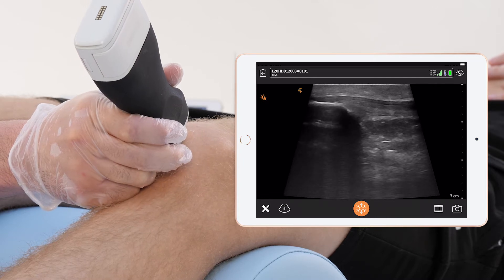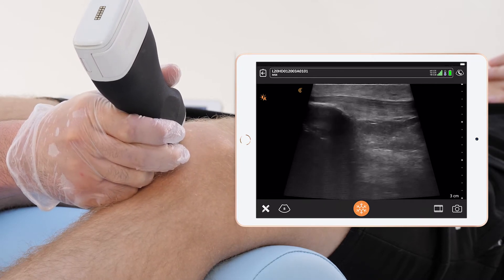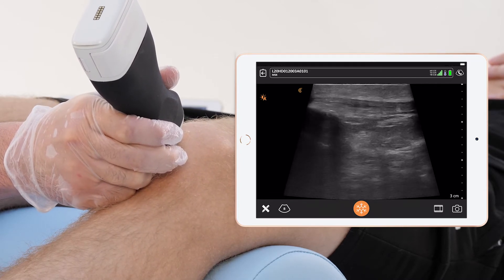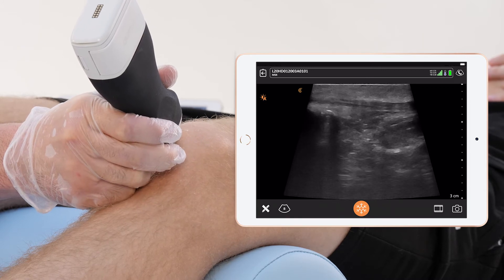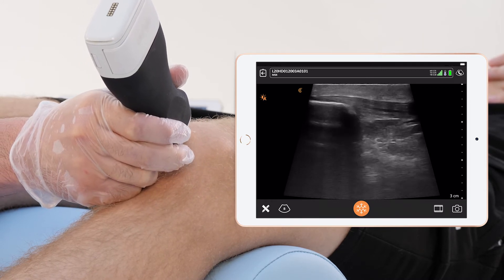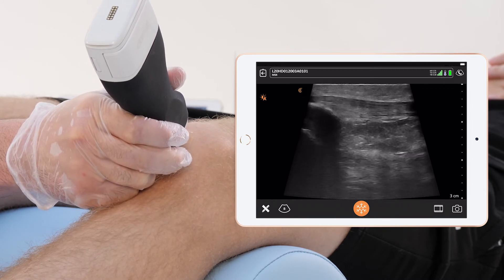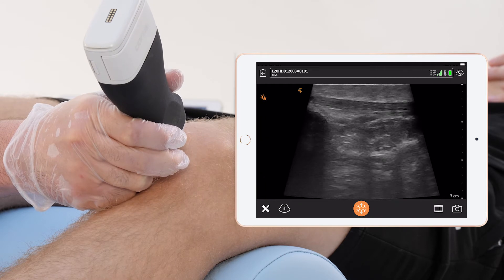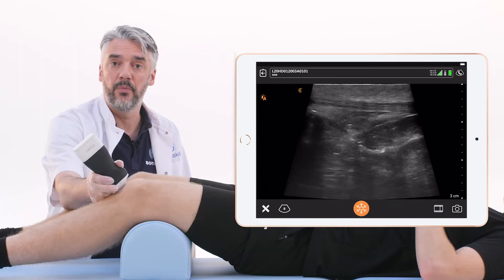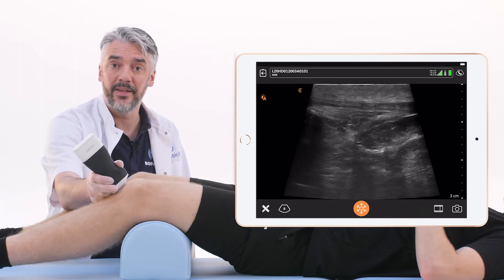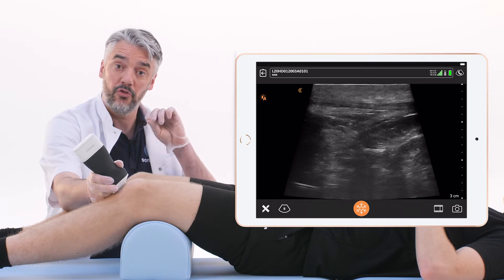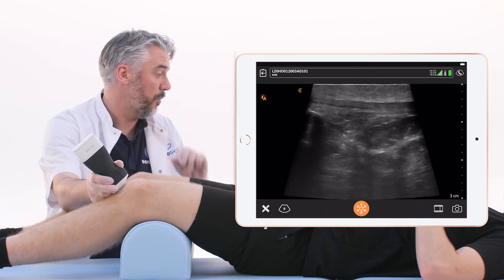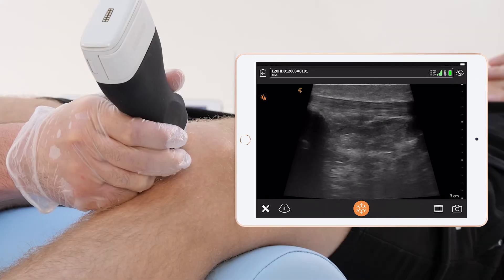Make sure that you scan really from medial to laterally in order to obtain the most optimal view. What we want to see is a nice hyperechoic tendon; the fibrillar pattern should be seen very well with parallel lines.